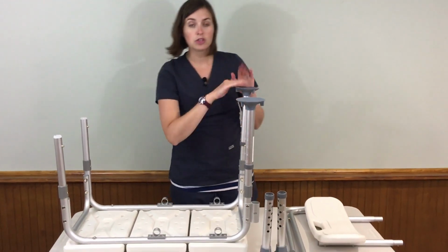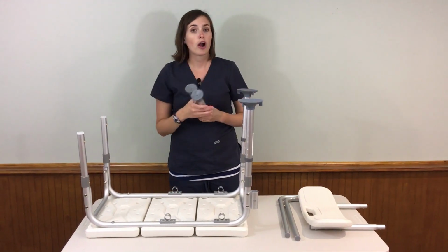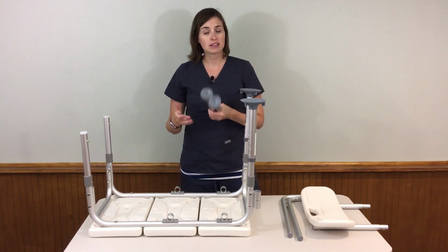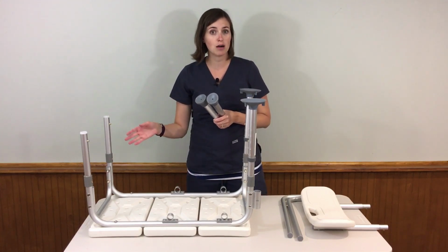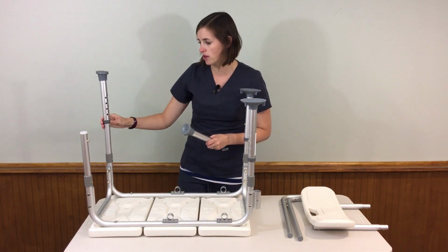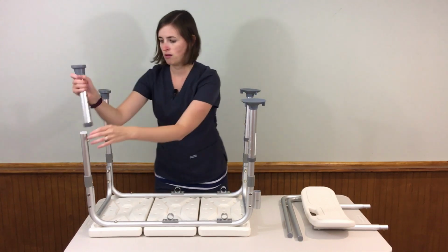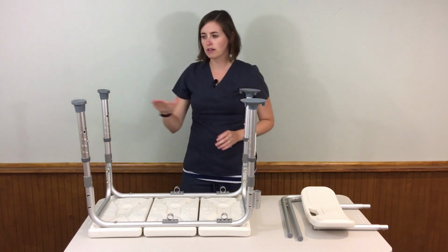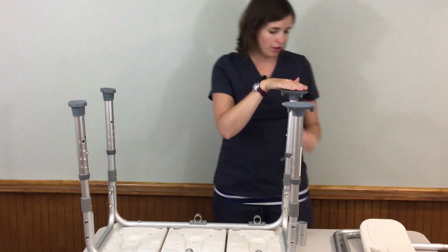Okay. These should be at the same height. Now in some tubs, the other side, which you're going to have these ones, aren't going to be at the same height because of the angle of the floor versus the angle of the tub bottom. That's something you'll want to address when you get to the tub. So if you're putting this together somewhere not next to the tub, you may be doing some adjusting when you get it into the bathroom. In this situation, I'm just going to keep them all at the same height. So this one's 5. And this one's 5, so it'll be all even. Now these 2 leg rests are going to be slightly slanted. The slant should be going in towards the other legs.